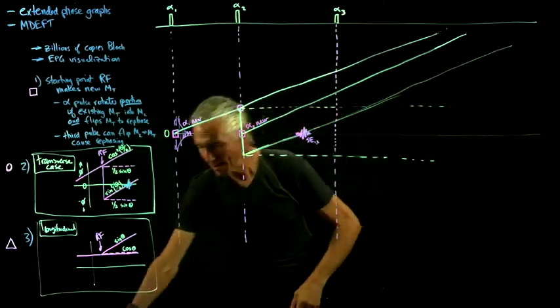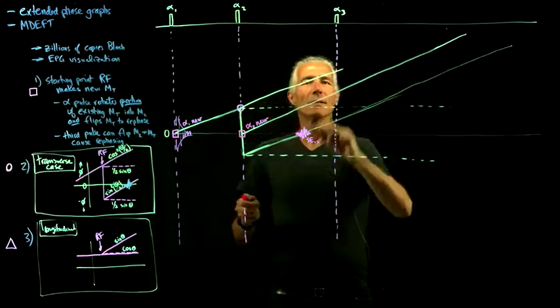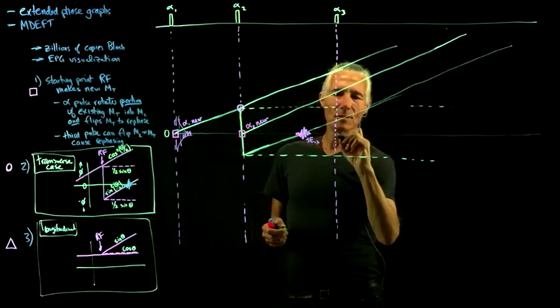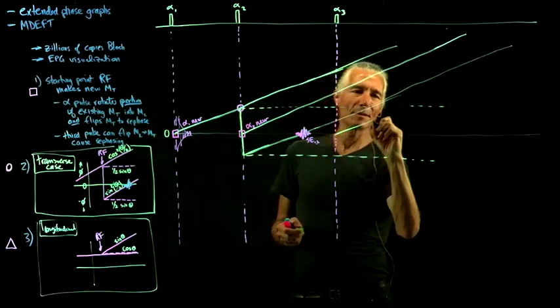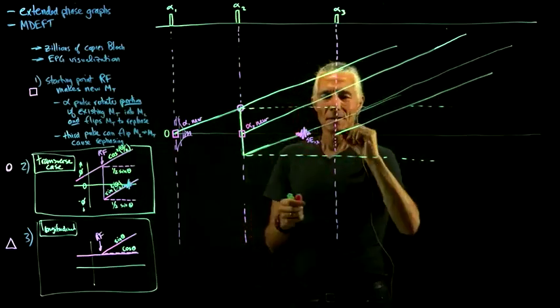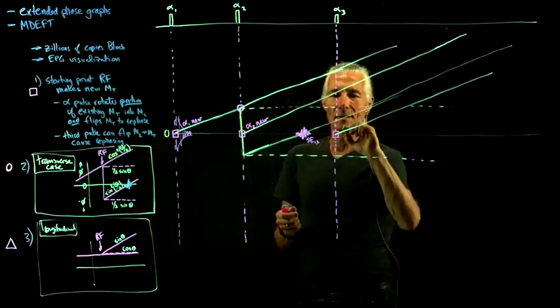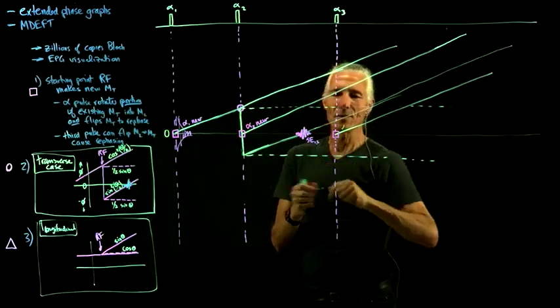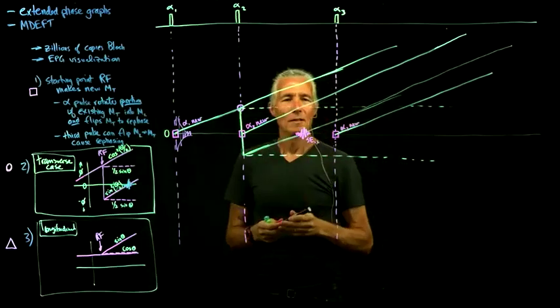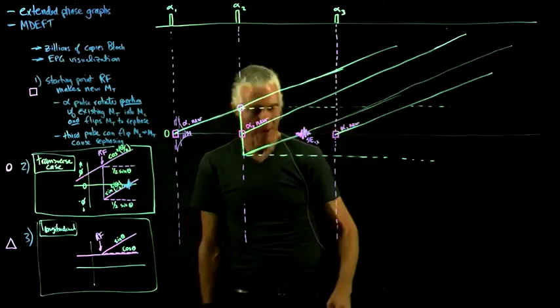So now we do the third pulse, and so the third pulse will create some new magnetization of its own. So there's going to be yet another one coming up here, like that, and that's a case of creating some new transverse. This guy is alpha 3 nu. But then it's going to hit all these other pathways.